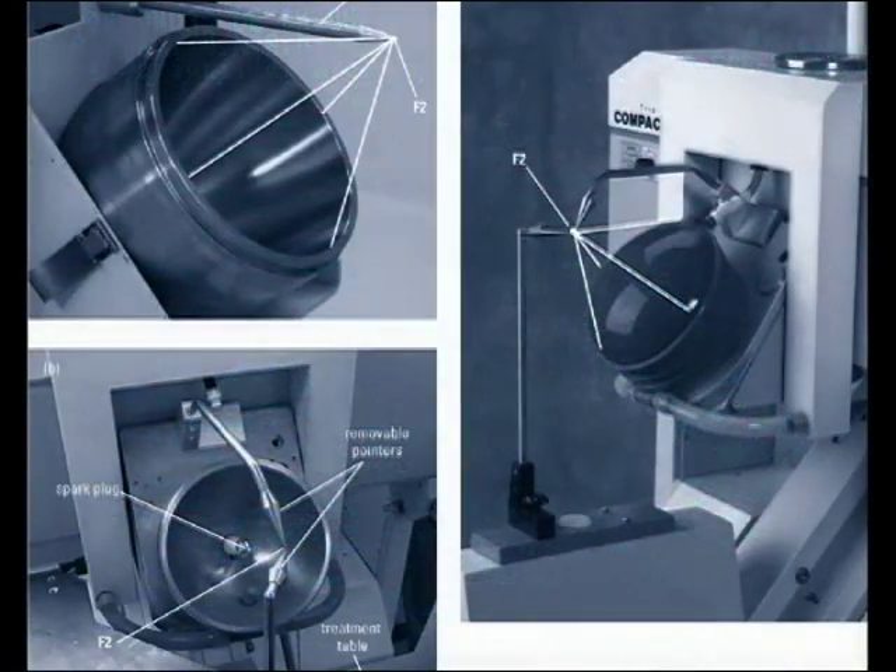The first step before starting treatment is alignment between the shock wave generator and the imaging system. This is performed by two projections of the fluoroscopy system while a pointer is placed at the focus. Bad system alignment can result in poor fragmentation outcomes and tissue injury.